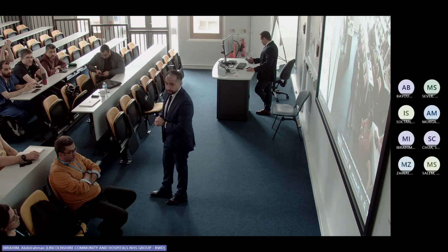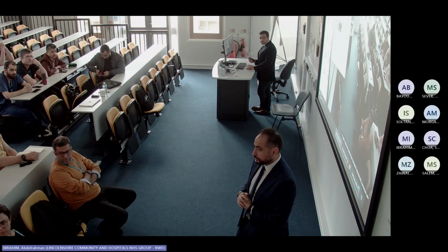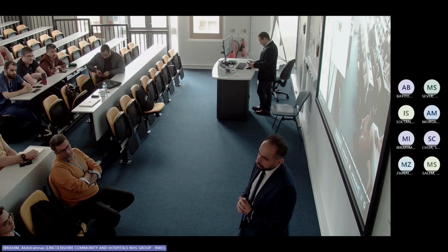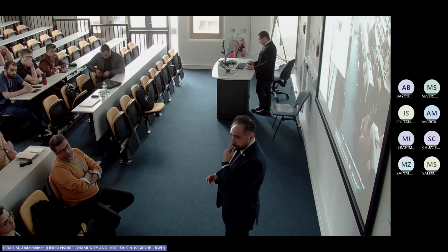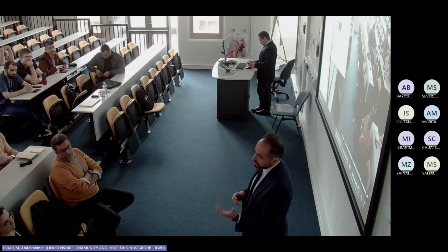Can we repeat the procedure if the symptoms return? Yes, you can. If the patient has improvement after 6 weeks, they feel better and then start getting worse, then you can give them another session, but it's not a rule. It depends on the symptoms and the patient's improvement. Some patients say, I didn't feel anything, so I don't think I'm going to do it to them again. Some patients say, I felt improvement. These are the ones I offer a second one.